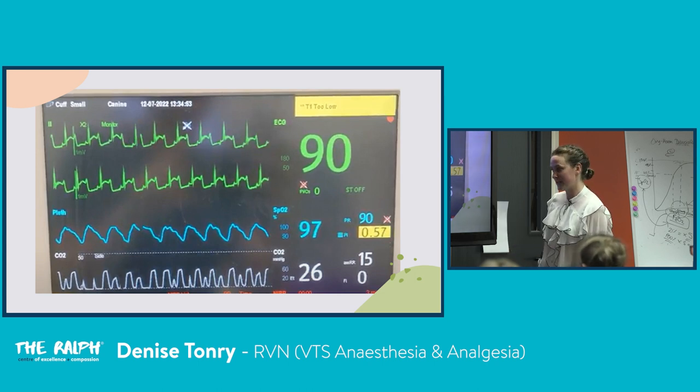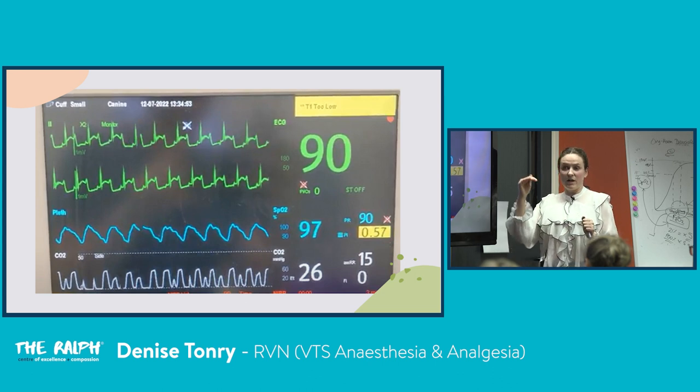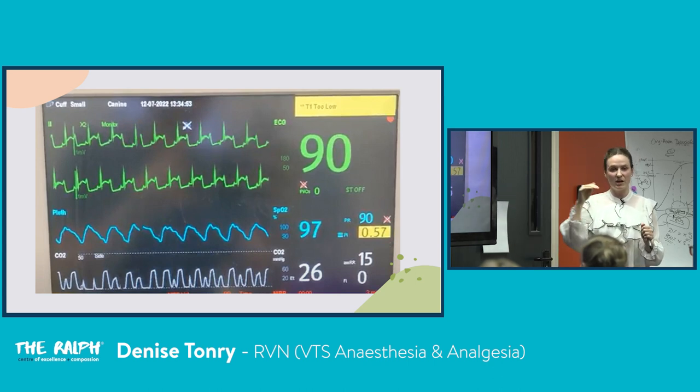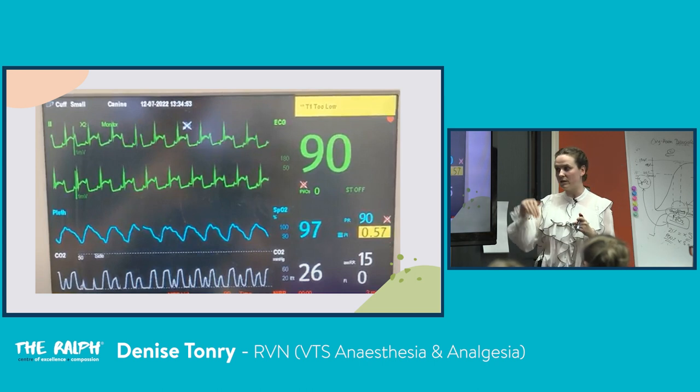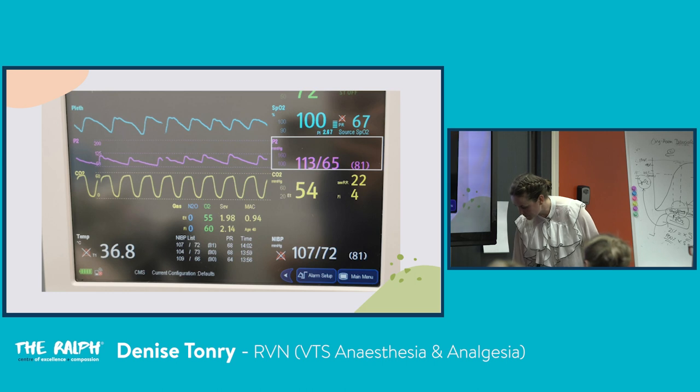So in this patient, I would ventilate them, or I would try to balance their plane of anaesthesia, if that's what you have available. You can add some alpha-2s, or you can try and bring their depth. So you could potentially IPPV this patient for a while, because when they're breathing like this, they're just not getting ISO in and getting it to the alveoli, getting the level of ISO up in the system. So they're just not falling asleep. They're staying in this awake state, a light plane of anaesthesia. So you could do that, and then hopefully over time they start breathing a little bit better.